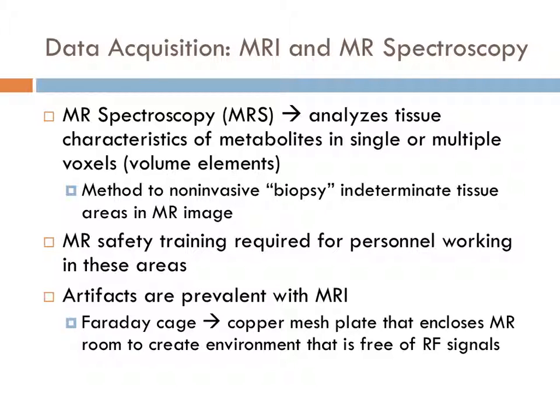One very important part of MRI is that safety training is absolutely required for personnel working in and around these areas. I'm sure you've heard a few horror stories involving MRI, maybe someone bringing a non-specific MRI wheelchair into the room, or possibly an oxygen tank being brought into the room.